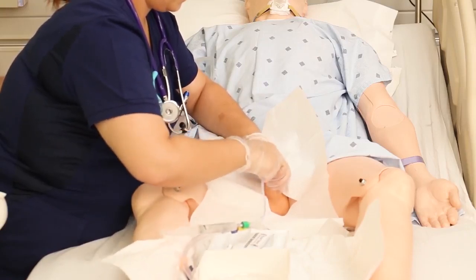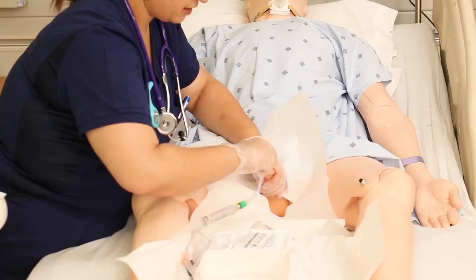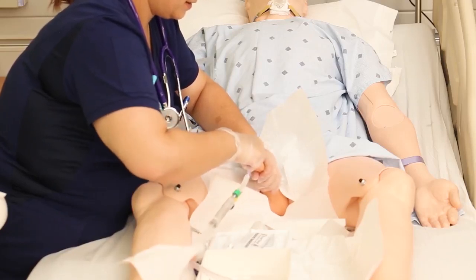If you have a patient with prostate issues and you're meeting some resistance, sometimes lifting up on the penis helps. For severe prostate issues, the other option is to get a coude catheter, which is a bit firmer at the tip and makes it easier to navigate past the prostate.